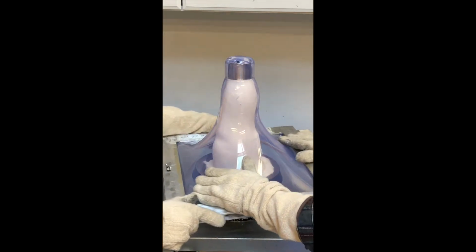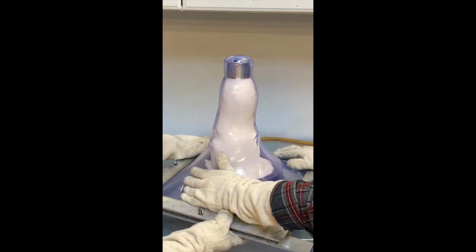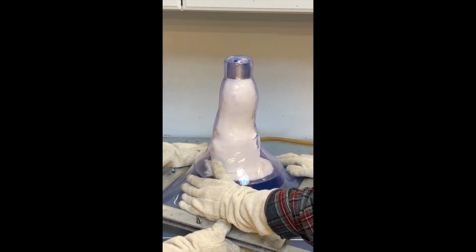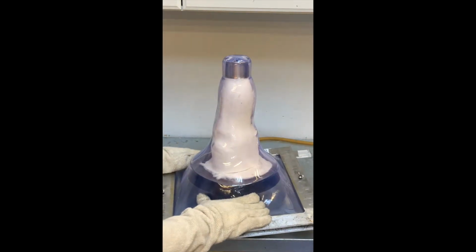Always be sure to blister form your check sockets for a distal puck system. Drape forming a socket will result in a vacuum leak in the seam area over the molding dummy.